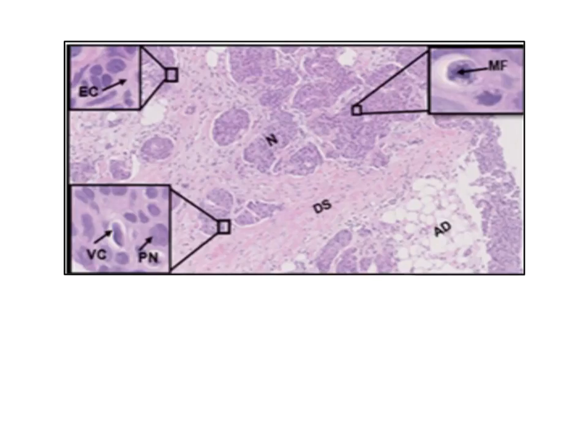The figure here shows the H&E staining, which revealed the non-appearance of glandular structures due to the invasiveness of the tumor and the presence of low severity of microcalcification with pleomorphic nuclei, PN. Furthermore, the tumor cells convey a lack of differentiation and anaplastic duct cells due to the dysplasia and malignant transformation.